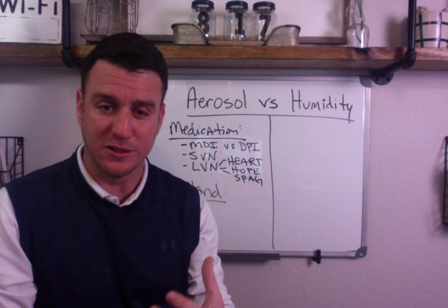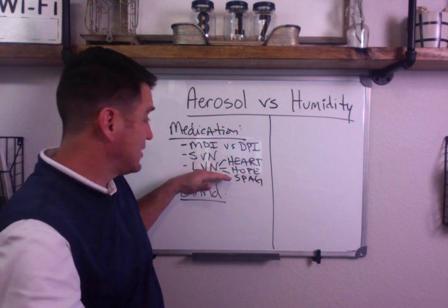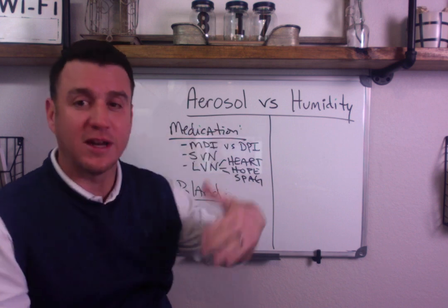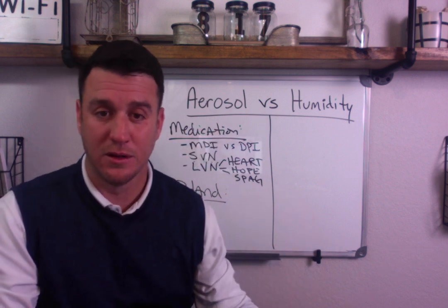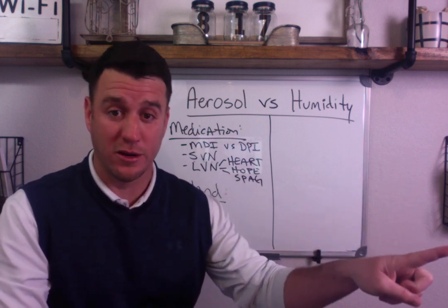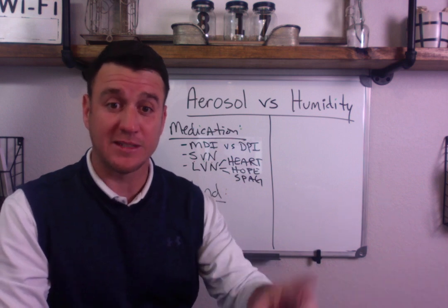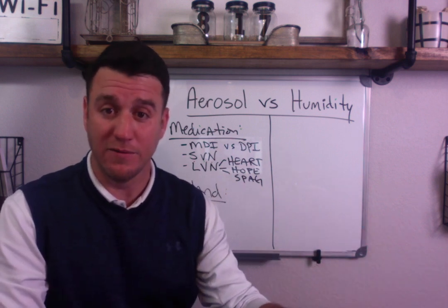The importance here is understanding that those are large volume nebulizers to aerosolize medication over an extended period of time. Okay, so that's kind of where we go here. Don't think SVN in Heart. Now, when I say Heart, I'm talking about the brand name of the nebulizer. When I say Hope, I'm talking about the brand name of the nebulizer.